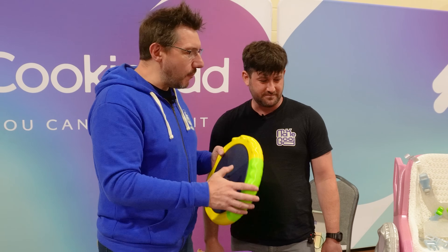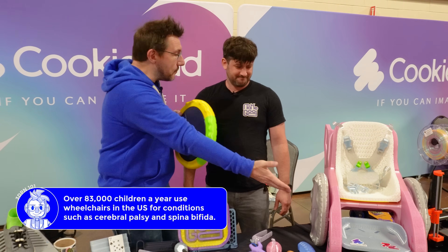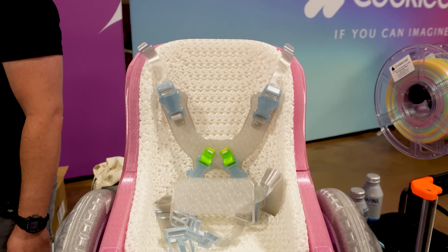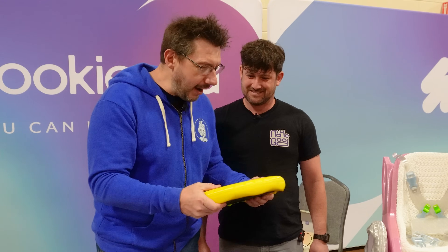With the kids that are going to be in this — somewhere between two and eight years old — those kids are going to want customization. Like this is a pink mobility trainer. And it's curvy and organic in nature. Being able to customize the experience for kids is really going to help them adapt to it.